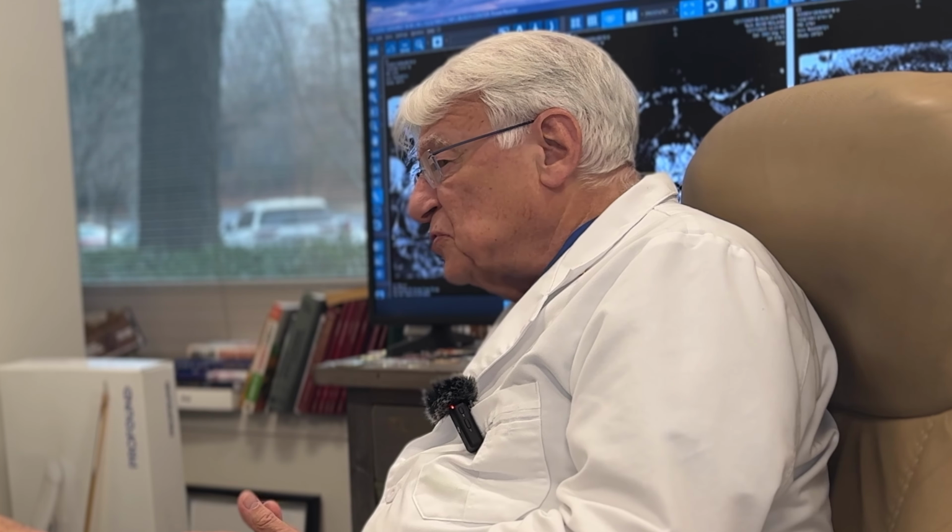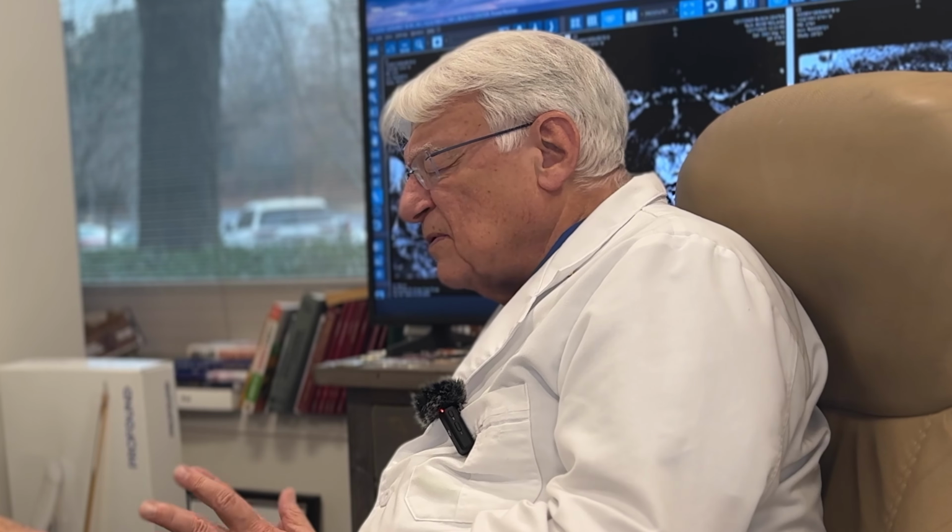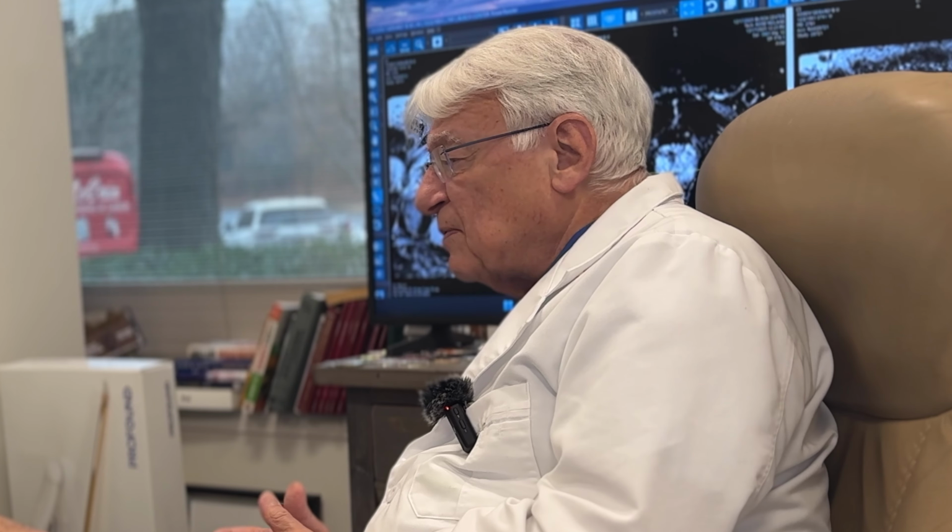Correct. Change the angle of the transducers. In other words, the UA, the applicators, the 14 megahertz or the 4 megahertz, we can actually change the angle that it's shooting at the calcifications. And we find that very important. We can also make decisions about should we boost the rectum to change the angle. So there are a lot of decisions you have to make with calcifications.